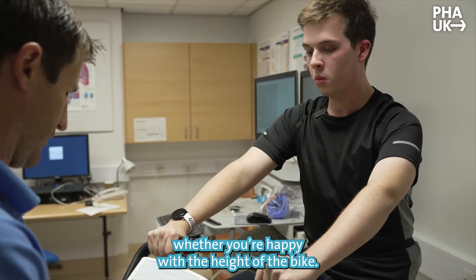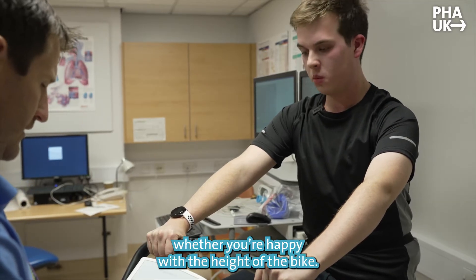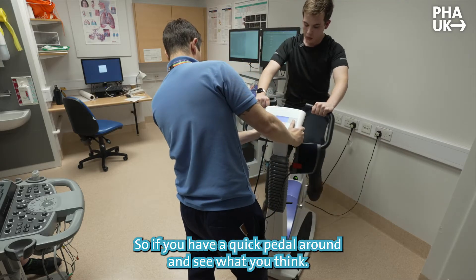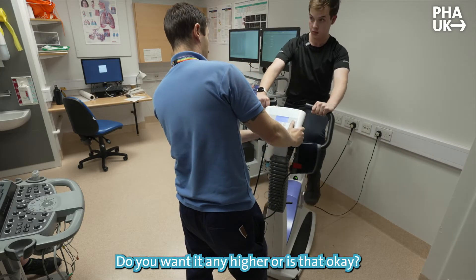I'll let you have a quick practice in a moment just to see whether you're happy with the height of the bike. If you have a quick pedal around and see what you think. That's comfortable? Do you want it higher?